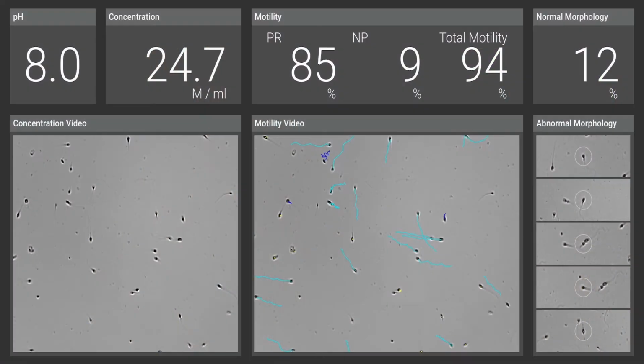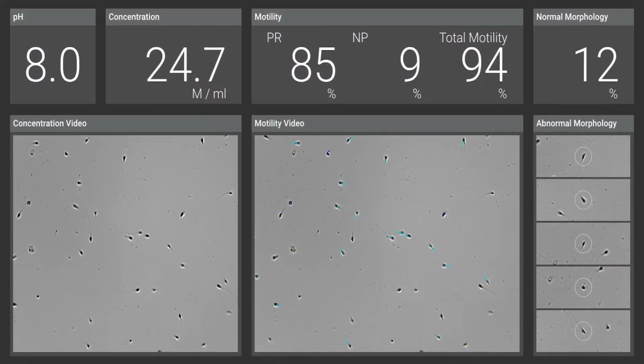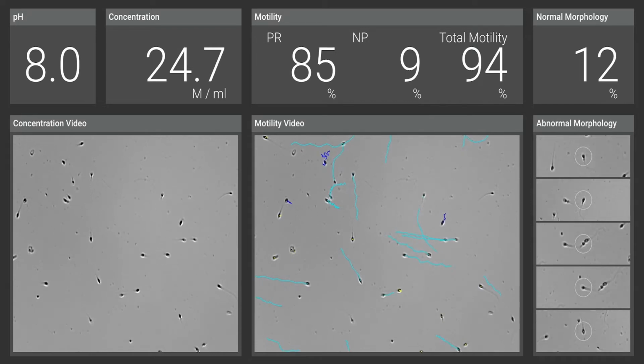We spin the semen sample in a special solution to isolate the good quality sperm. We then wash the isolated sperm to clean the sample ready for insemination. We have a new technology in the lab called CASA, Computer Aided Semen Analysis. This technology tracks the sperm and tells us how well the sperm are moving, how fast and if they look normal, and it helps us inform which treatment would be the best for you, IVF or ICSI.